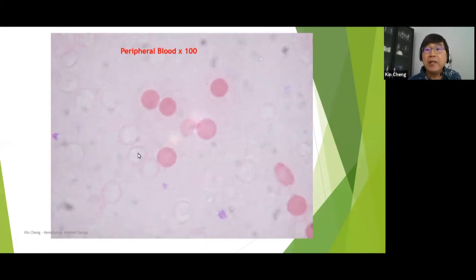Yeah. So higher magnification again shows that there are holes. Now, don't mistake these so-called holes for what people sometimes say, oh, the slide is dirty, that's why you have holes. But don't forget, you look closer. If it's a dirty slide, with oil droplets, these holes are not uniform. But in this case, every single hole looks quite uniform. They're the size of the red cells. That's why these are ghost cells. Okay, so again, that's 100 times magnification.